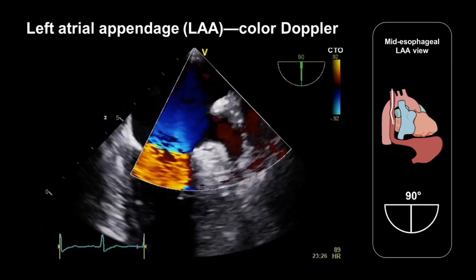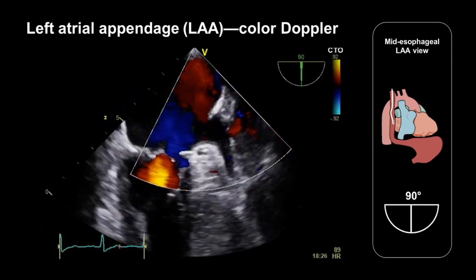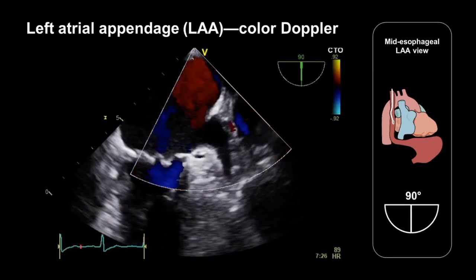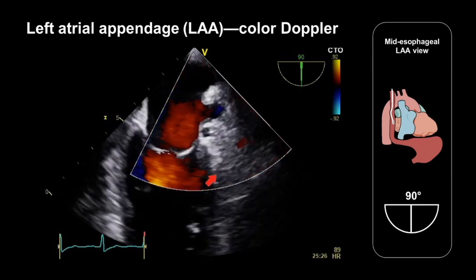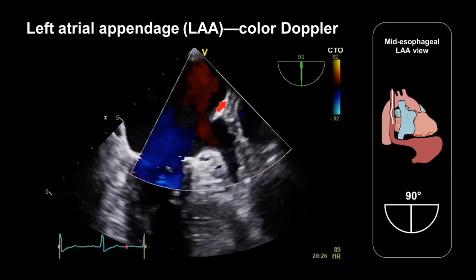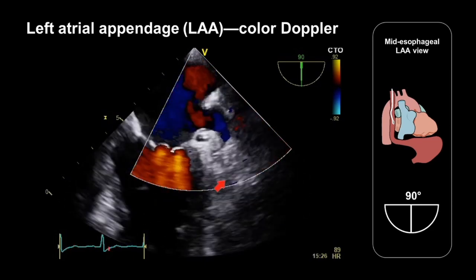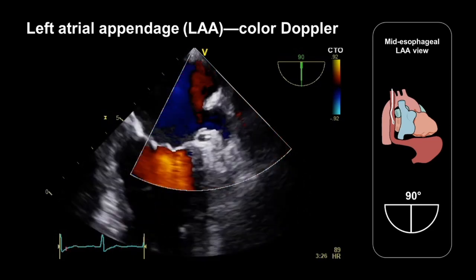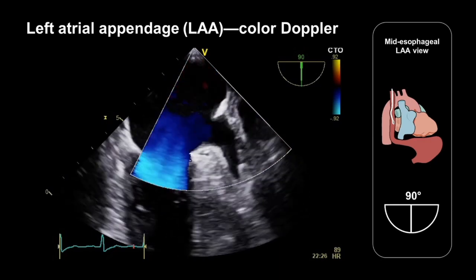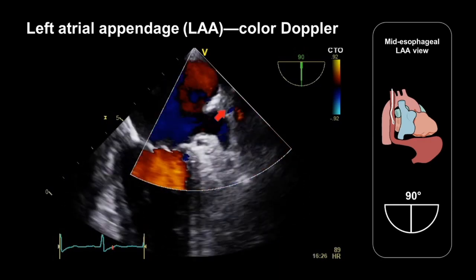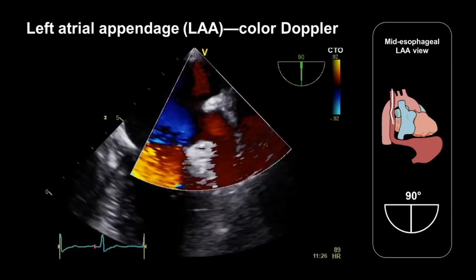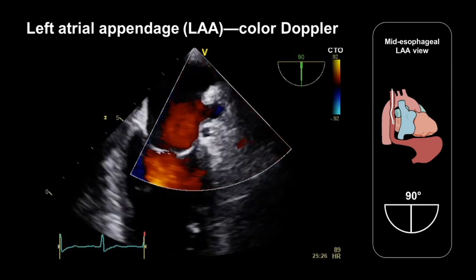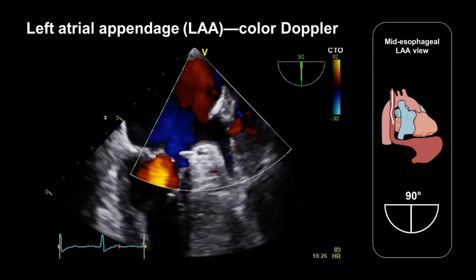Once we've assessed the anatomy of the left atrial appendage, we should apply colour Doppler, which can help us to assess the full extent of the appendage. The presence of colour within the appendage makes it easier to see exactly how far it extends.